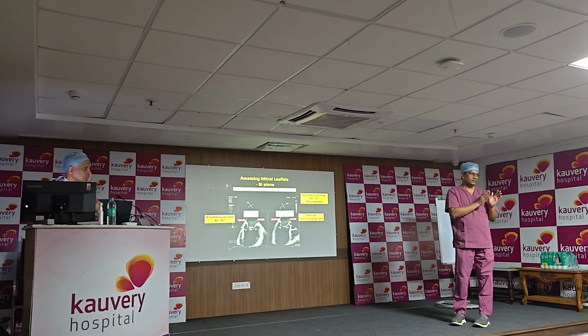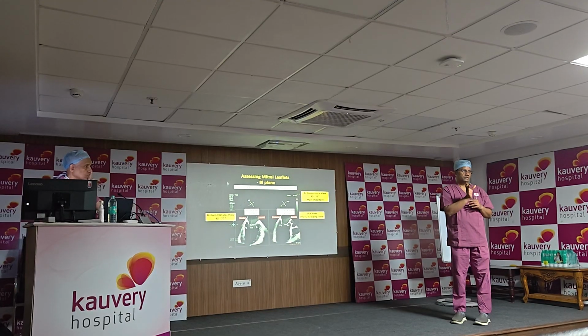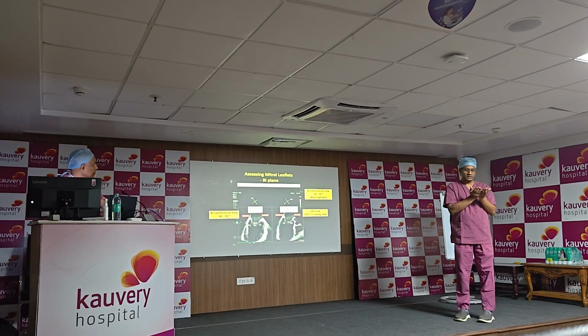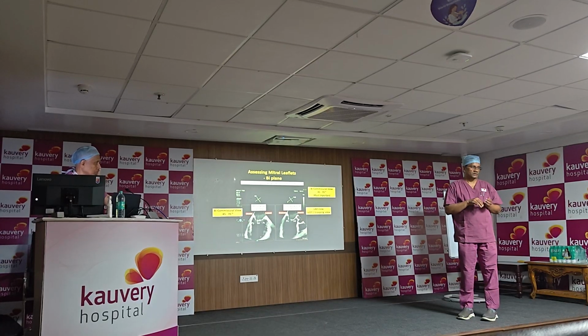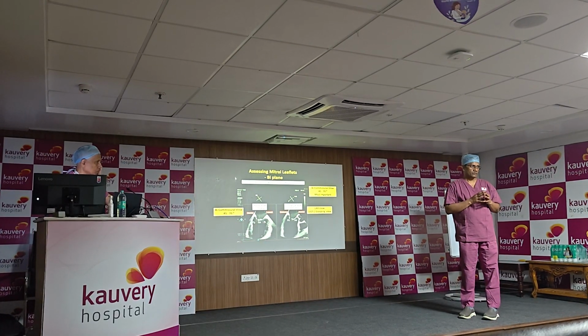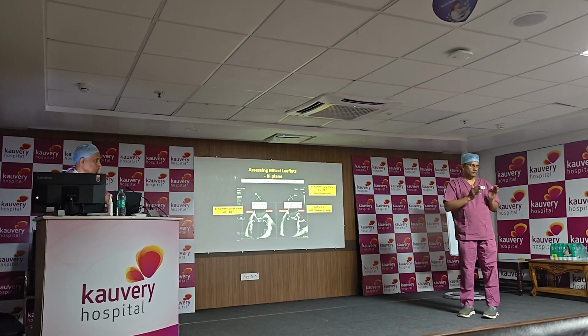Same thing with the N and NTW. So what we used today: the first one was XTW, because we wanted a larger width to cover the whole length of that line segment. And the second one was XT, so a longer arm but narrower.